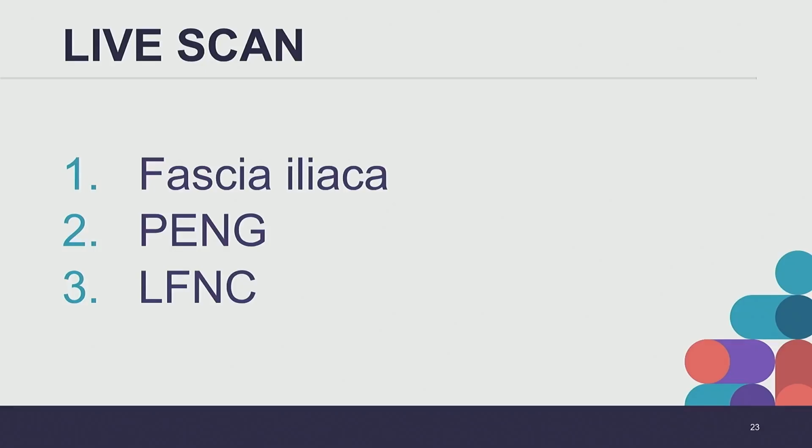Now we're going to go to the lateral femorocutaneous. So there's our femoral artery. We're going to scan laterally.